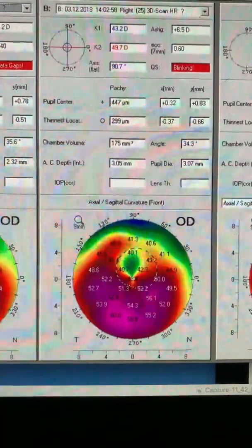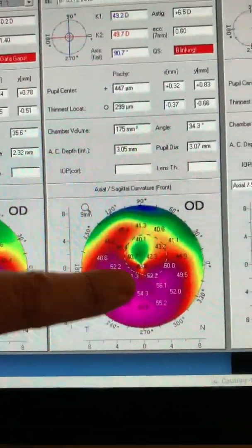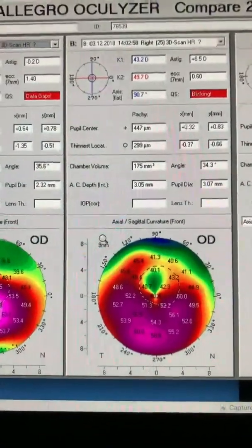Here in December, 11 months later, you can see a dramatic flattening. Our steepest K is in the 50s, low 50s. Cornea thickness is an artifact from the Pentacam, and it's not 299, it's about 380.